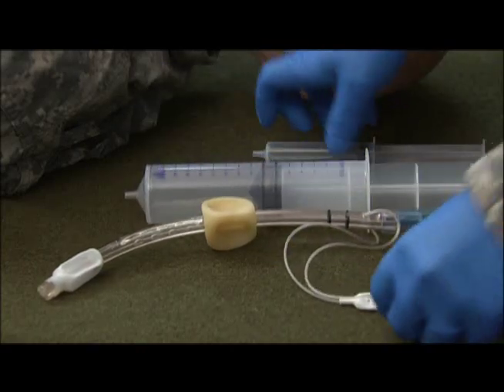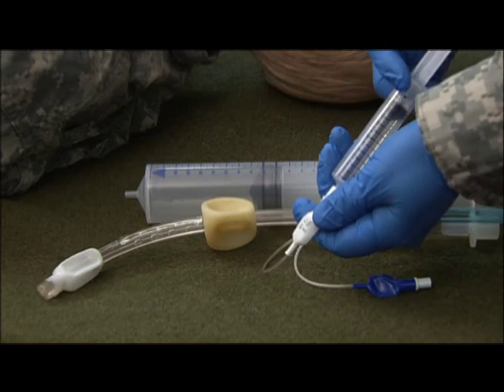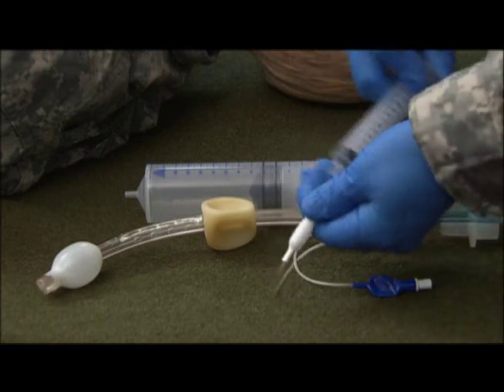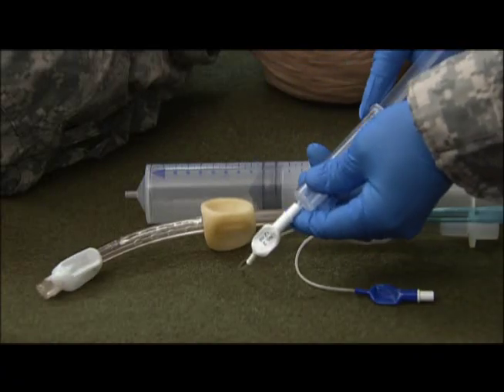Then we'll move on to the smaller syringe with the white adapter. This is 12 cc's of air. Disconnect, test, and re-deflate.